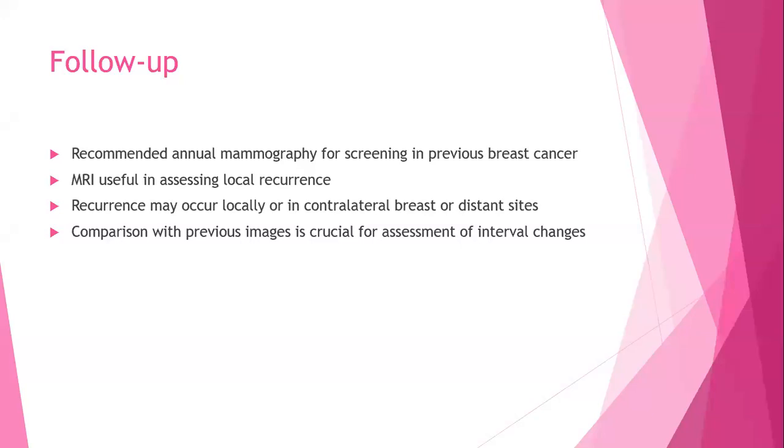And also of importance is a comparison with previous images. A lot of our patients who are on follow-up will come, and at times they tell you they've lost images, they had the previous mammogram 2 years ago, they don't have the images. Sometimes they've been done at different facilities. It's important to tell our patients that they should have all their hospital documents. So anytime they come for any other imaging or procedures, it's important for them to have those records, because then it tells us where we started from and whether we have stable disease or interval changes.